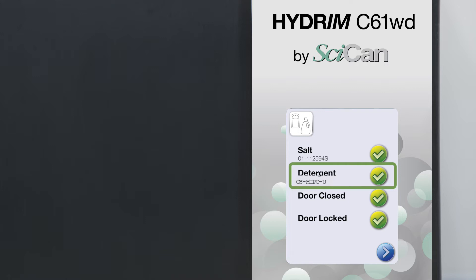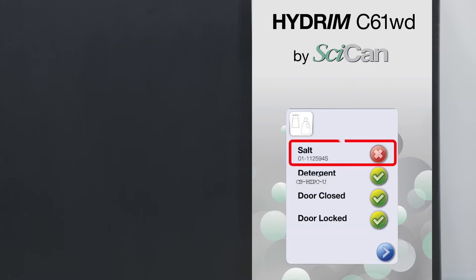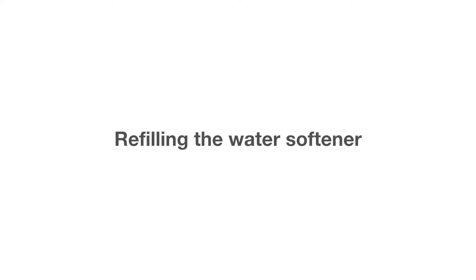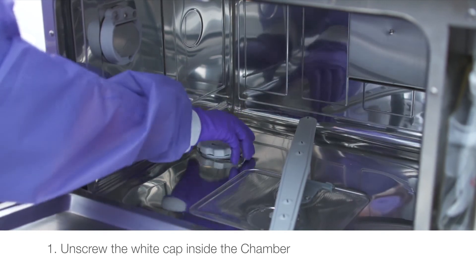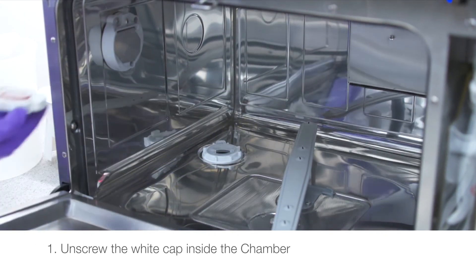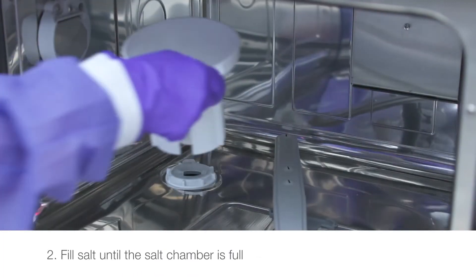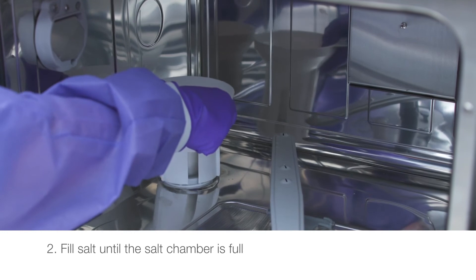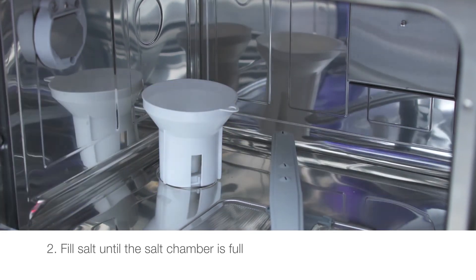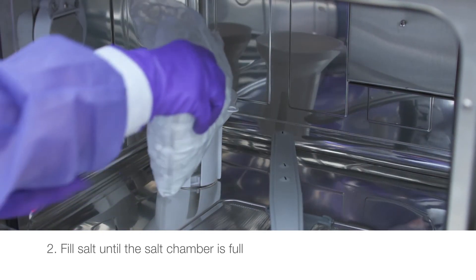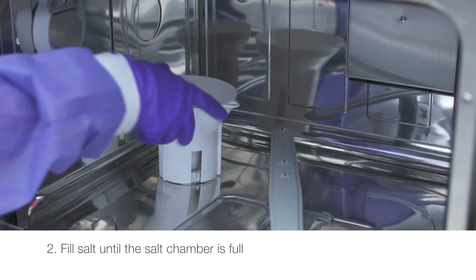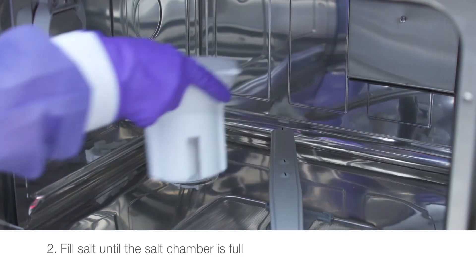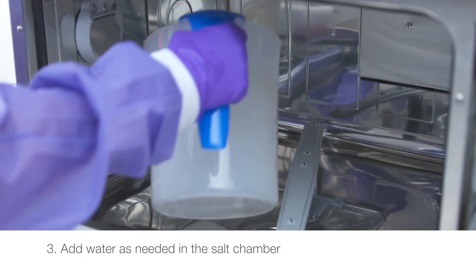If the water softener needs to be refilled, a red X will appear next to it. To refill the water softener, unscrew the white cap inside the chamber. Fill salt until the salt chamber is full. Add water as needed in the salt chamber.